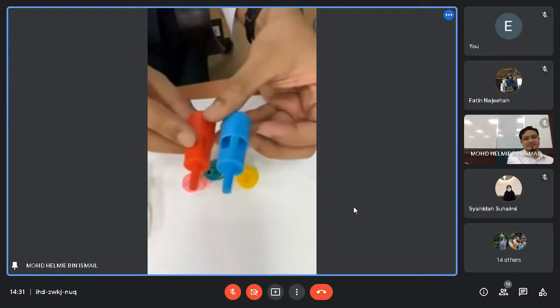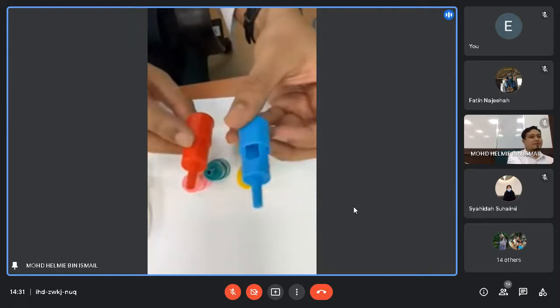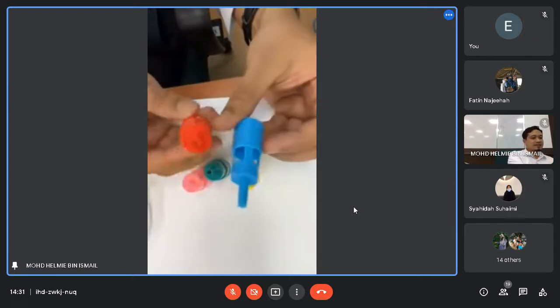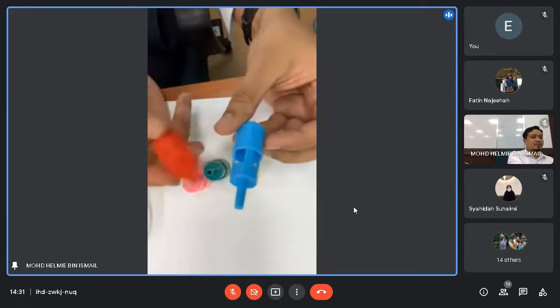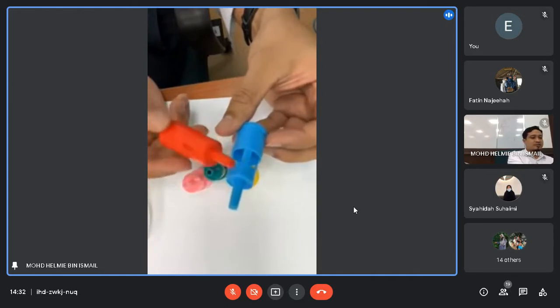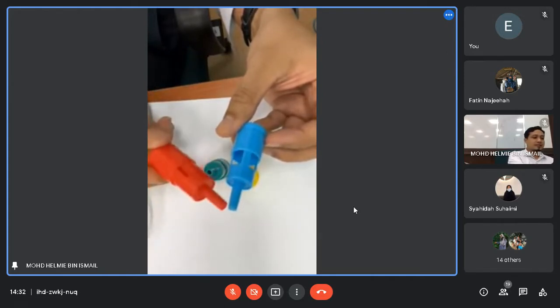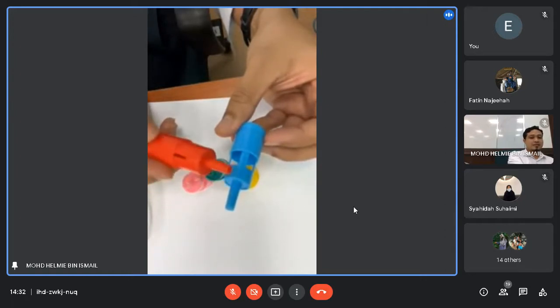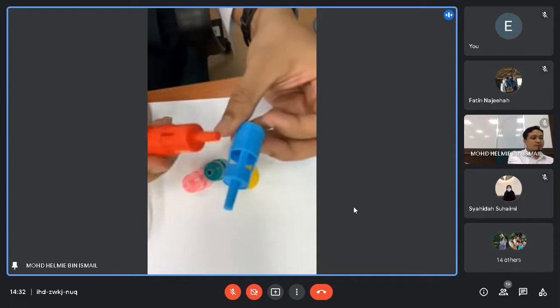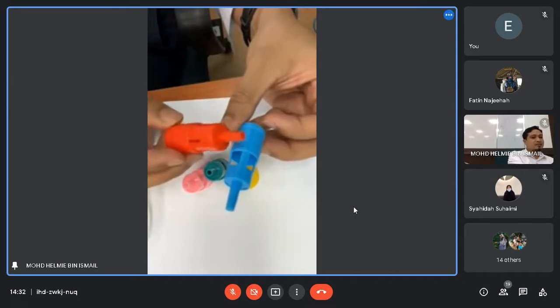Don't remember? Go back and read about the Bernoulli principle. Basically, we connect to the oxygen supply and give airflow inside the venturi valve. The faster the airflow, the more it creates a sucking effect, a sucking pressure.